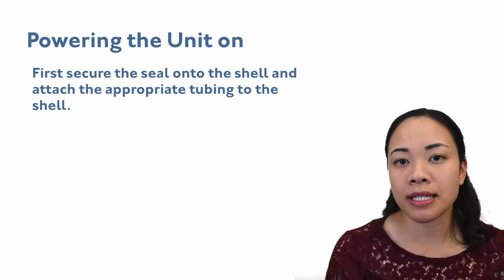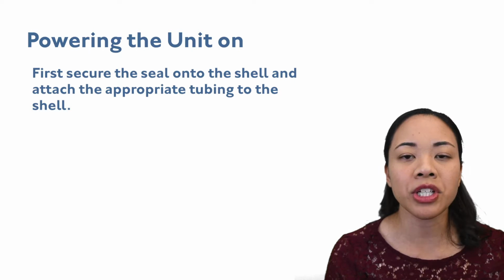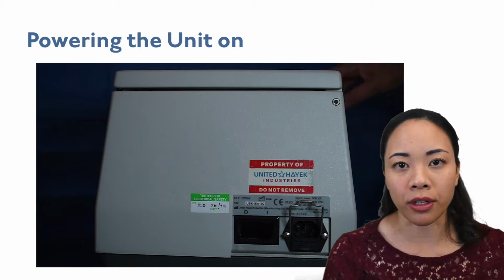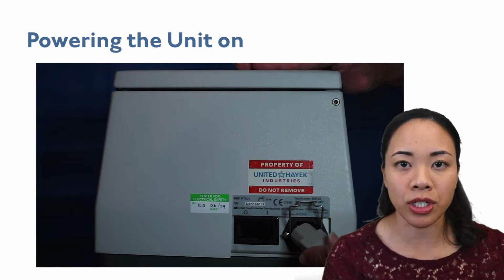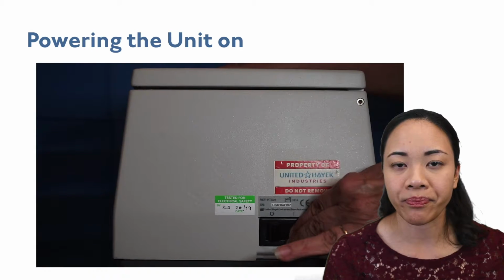Once we've secured the seal onto the shell and attached the appropriate tubing to the shell, we shall now turn the machine on. On the lower right corner of the right side of the machine is a black toggle power switch. Press to power on.